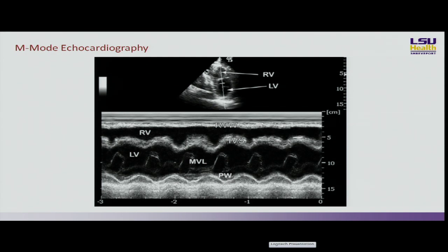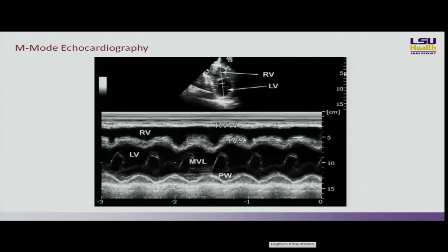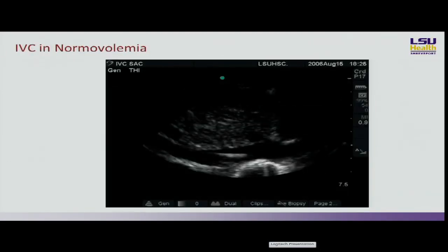And this is the septum right here, and you can see it contracting with systole. And this is a posterior wall. You can see it going up, contracting with systole. It gives you a more quantitative assessment of how much contractility is going on. And here you can see the right ventricular free wall is not moving very much. The RV is hard to visualize on echo, but it often doesn't move nearly as much as the LV. And I'll show you can actually make measurements from that.